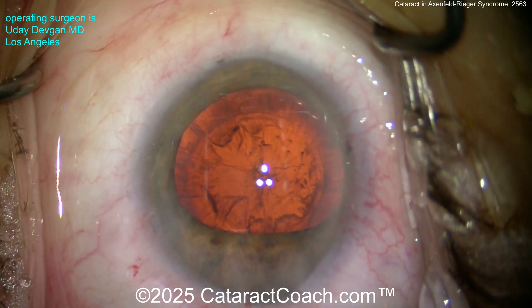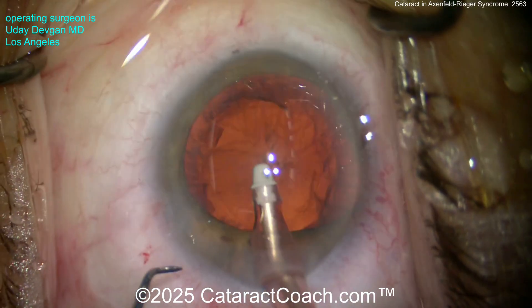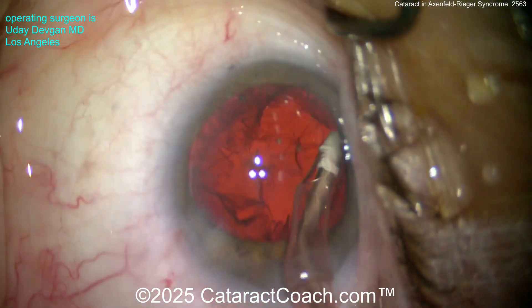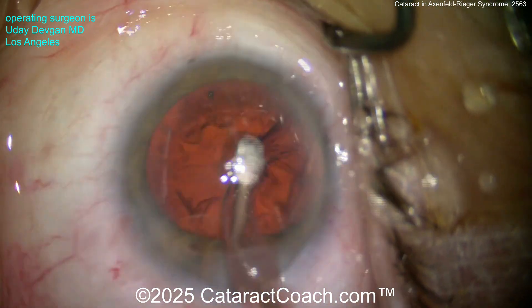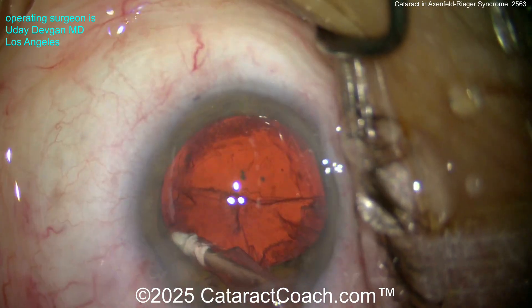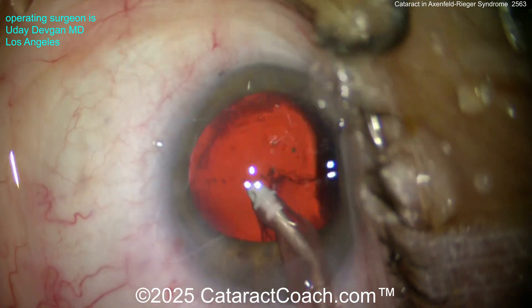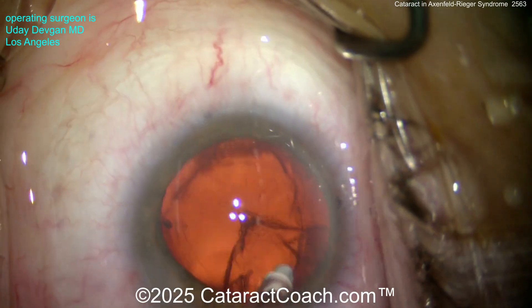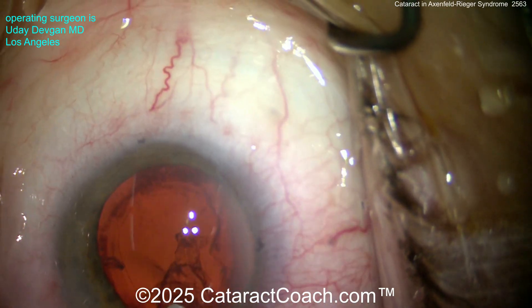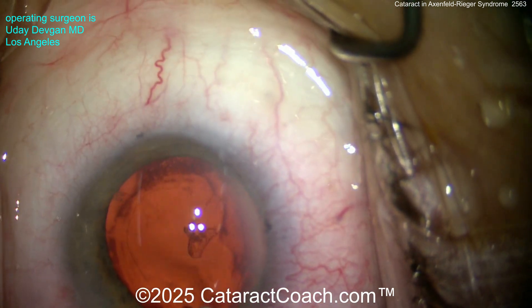This is where you have to be very careful when removing the cortex — you want to make sure you don't see any movement of the capsule or rhexis. We'll go nice and slow. Now aspirating that cortex — it comes out pretty easily, and the rhexis is not moving. That tells me there is pretty good zonular support. I don't see any indications of weakness in the zonular support at all. At this point, I'm thinking I don't need the capsule tension ring — I prepared those ahead of time, but I don't think we're going to need them.